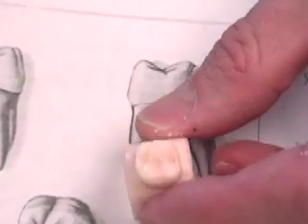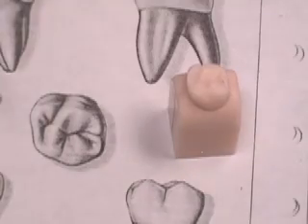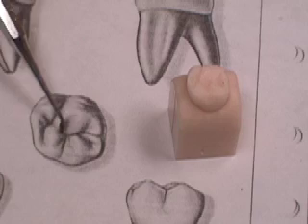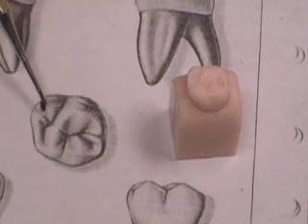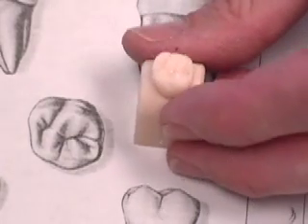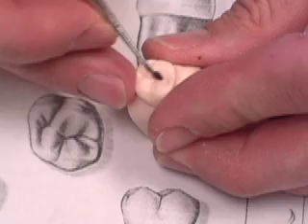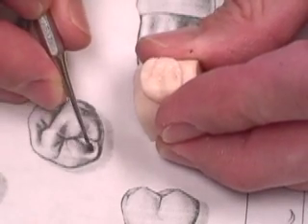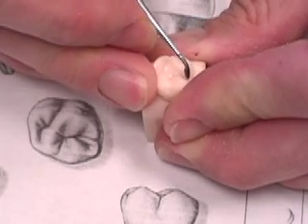At this point we're going to come over to these pictures and start to true up. Primary anatomy are the main grooves down through the center of the tooth — you can see them through here. Secondary anatomy are these little finer grooves, like this one, and these little extensions. So we'll start working on some of that finer anatomy now. Just going to start on this side and work my way around. There are some little radiating points off of there, so we'll radiate out a little bit.